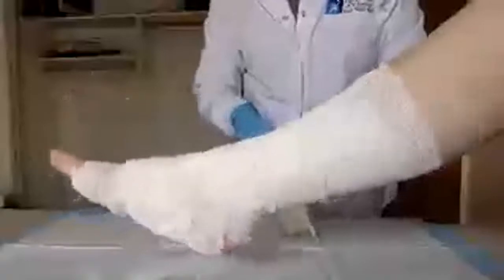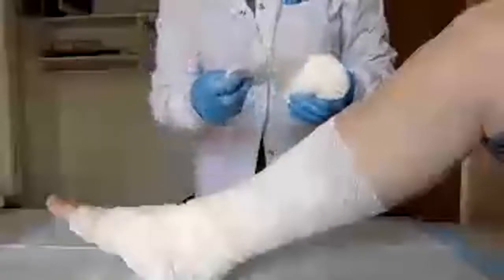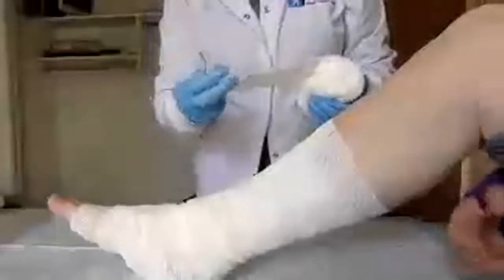Okay, now then, you want to get a roll of the gauze. And you can take your gloves off if you would like to, because it does coat your gloves pretty good. I'm going to keep them on for the moment just because I'm going right up against the zinc oxide and I want to keep them for doing this whole process. Well, I'll get some new ones. So once again, you want to make certain that you have straightened this out so there's no extra thicknesses to create any sort of pressure on the skin. And with the gauze, you're going to do the exact same thing as what we did with the zinc oxide gauze. So zigzag back and forth.